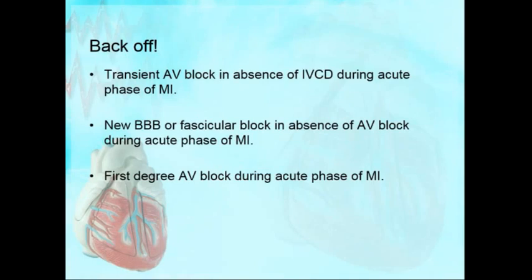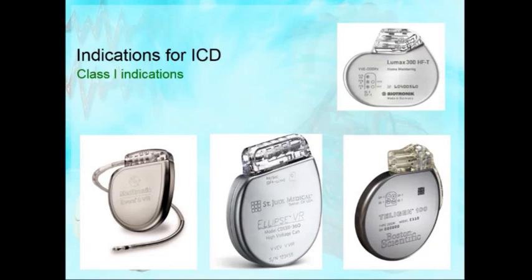Okay, let me see. Get this PowerPoint, you will get it. I had to put in different devices and how they look and all kinds of stuff, first for teaching purposes. Just to make it even, I'm not a spokesperson for anything, so I'm sure there's one from each company. Medtronic, St. Jude, all four big players are here. That way nobody complains, they're all here. They're getting smaller and smaller.